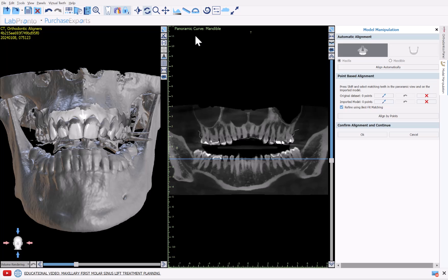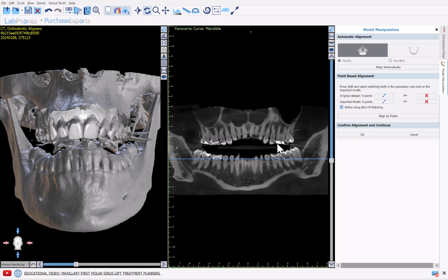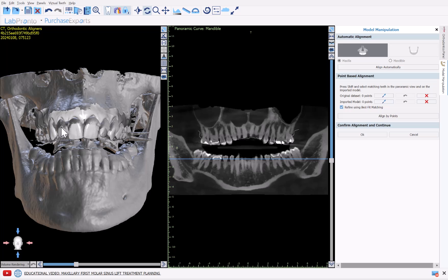And now it's asking us to confirm the alignment of the optical scan, which we can see here in white in the 3D view. And we can see the outline of the optical scan in the CT scan view. We want to confirm that the outline of the optical scan aligns to the CT scan. In the 3D view, we have the 3D model of the optical scan aligning to the CT scan as well. So I'm going to go ahead and click OK.